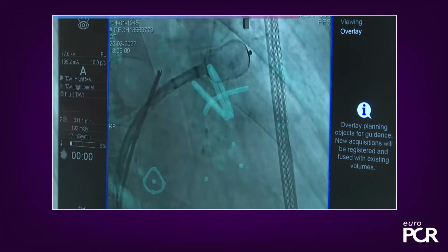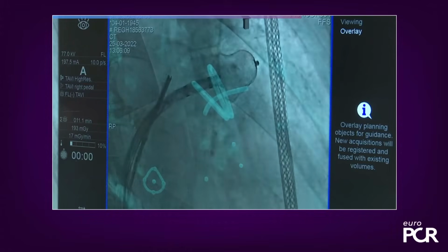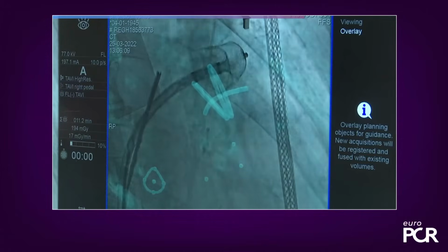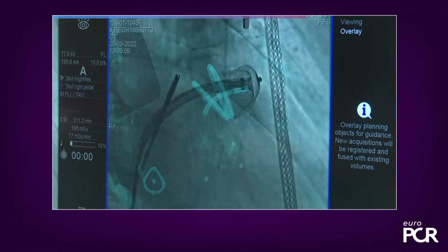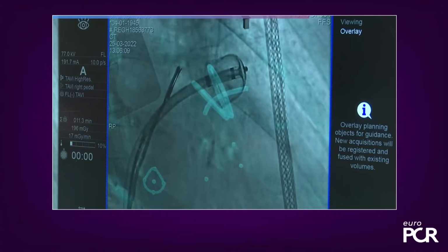Okay. And this is push a little bit out with the device still. Yeah. We continue. Yes, it's nice and well controlled. I like this very much. Can you make a little bit more like this? Yeah, like this. Perfect. That's really perfect. Okay, so the cup is formed.